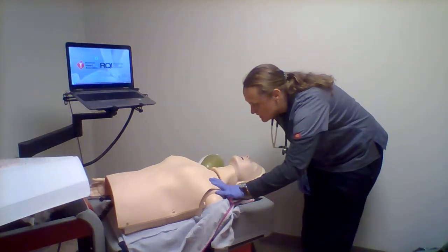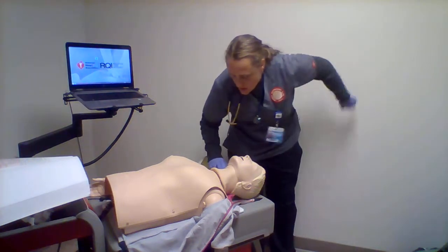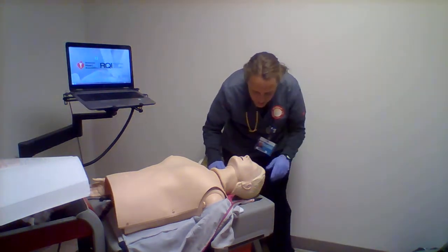Mr. Rodriguez, Mr. Rodriguez — already wearing gloves.